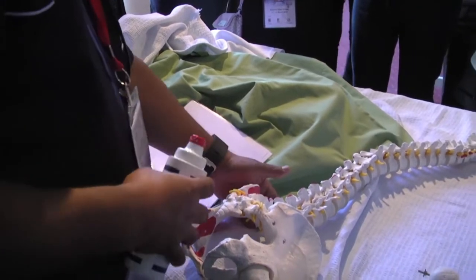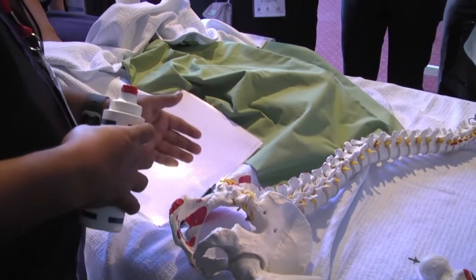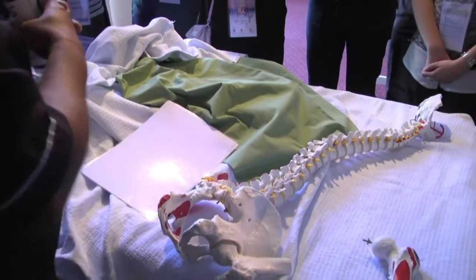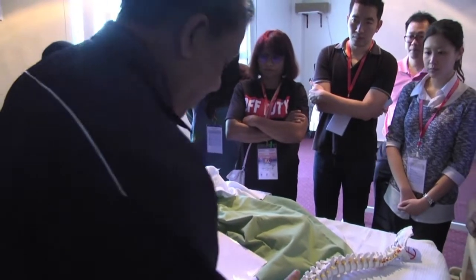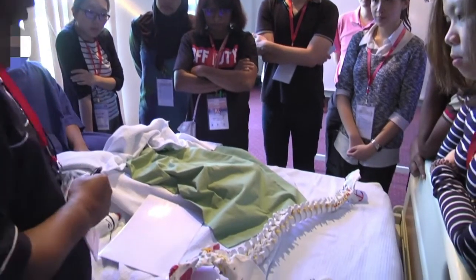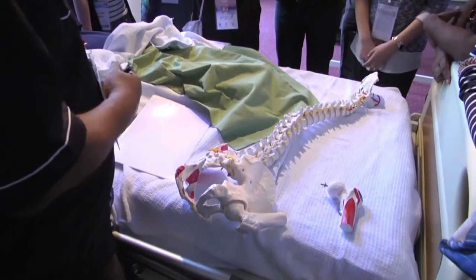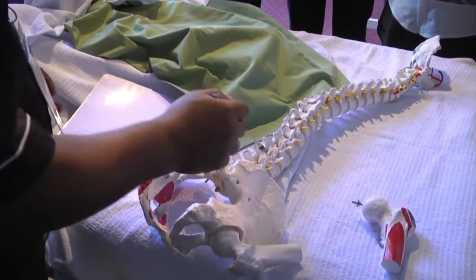There's a bone there and there's an acoustic shadow. Whether the person is 15 years old or 100 years old, the bone will always be there. But the acoustic windows will be narrower and narrower as age increases. So the important thing is to identify where these crevices are in this complex spine anatomy. When I first started doing imaging, I found it very difficult to objectively determine what structures you're looking at, and unless you know that, you can't really say this is the interspinous space or the interlaminar space.